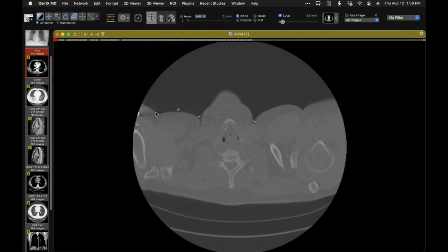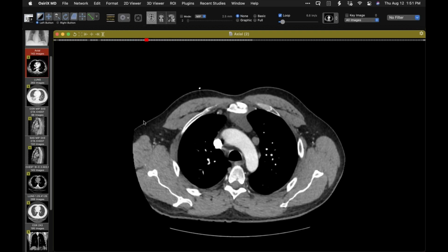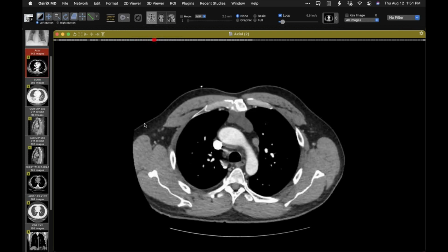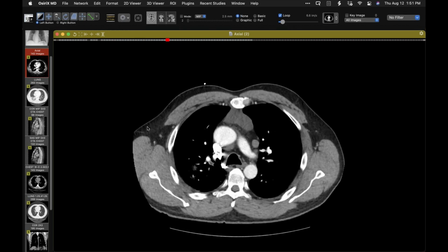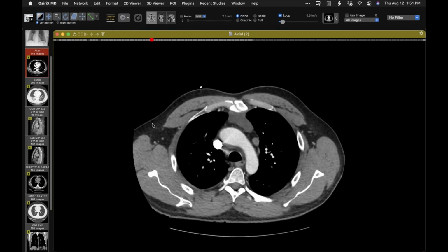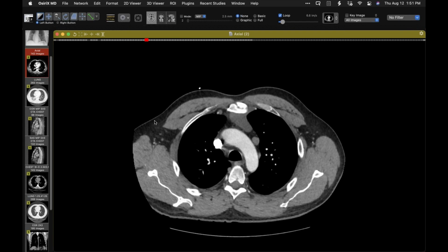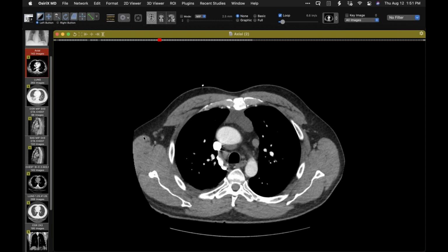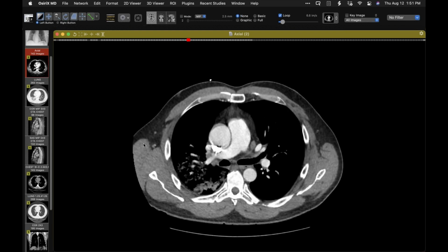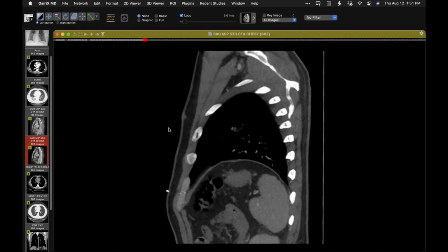My bias would be that for a case like this, when you have a contrast-enhanced CT, I don't think an MR actually helps, because rarely you'll see cystic thymomas that have almost all fluid and very little soft tissue. Maybe our spatial resolution isn't good enough, but if we did an MR on this, I don't think it would change anything, because this is pretty suggestive of a thymic cyst anyway. Yep. And then the question is, if you do the MR, do you do it now or wait 6 months and just ensure stability?